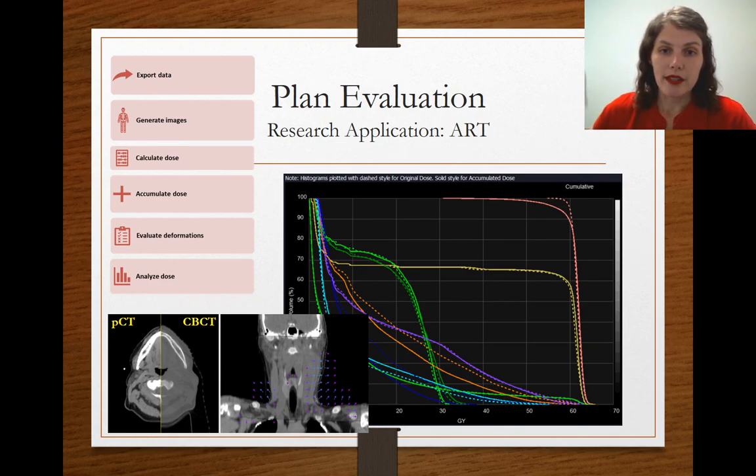And that's for our clinical practice, but we've also benefited in our research practice from the use of ClearCheck. So as I mentioned, we generate a lot of plans in this research. You can see our workflow shown on the left here. We're creating a lot of images, calculating dose on these images, and then trying to evaluate fraction by fraction doses for lots of fractions for lots of patients. And so in order to analyze these fraction by fraction doses for all of these adaptive plans, we needed a tool that was able to quickly analyze the DVH and give us a result fast. You can see here on the right, we have a composite analysis out of Velocity, but not necessarily a fraction by fraction analysis. And that's where ClearCheck has come in for us.